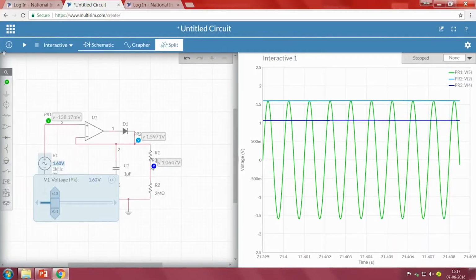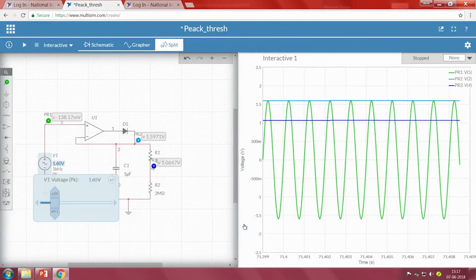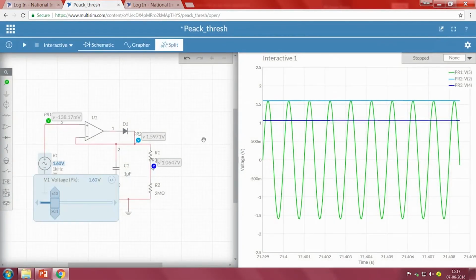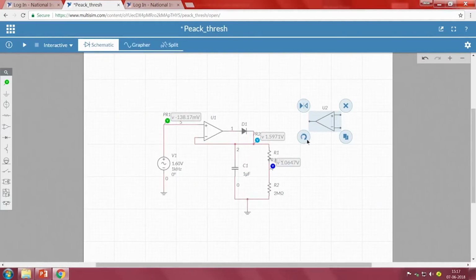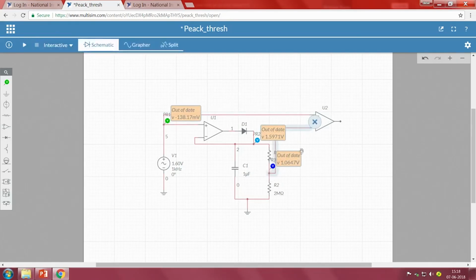I will go to Multisim once again. Let me save this circuit. I am opening a new file, or to this itself we can create an extension of it by using another comparator. So, I will go with the schematic and take one more op amp. Let me flip it. When you look into our circuit, to the positive terminal we are connecting the threshold value, and to the negative terminal we are connecting the input signal.